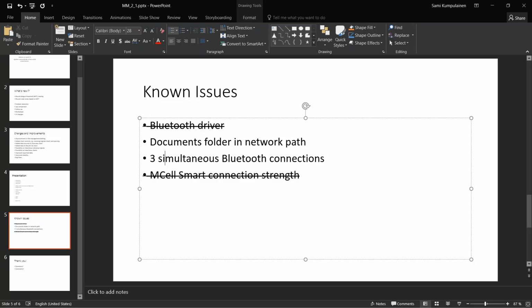Of course, we are always keeping an eye on whether Blue Giga is making changes to the firmware, so the dongle would accept more connections. Another thing is that Microsoft now released Windows 10 and came up with these universal Windows projects, which might have some native libraries for Bluetooth smart connections.